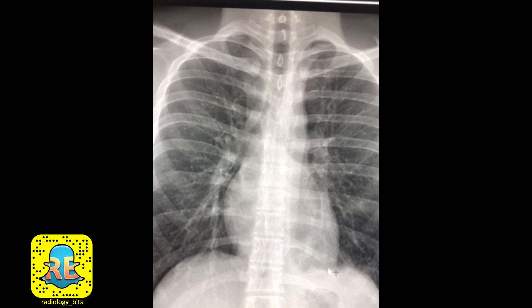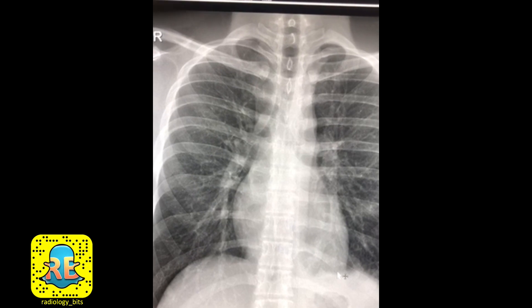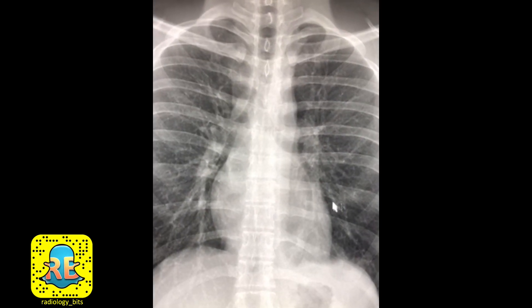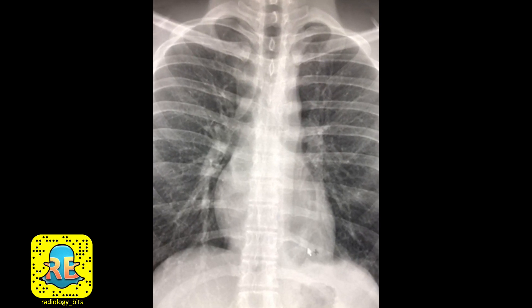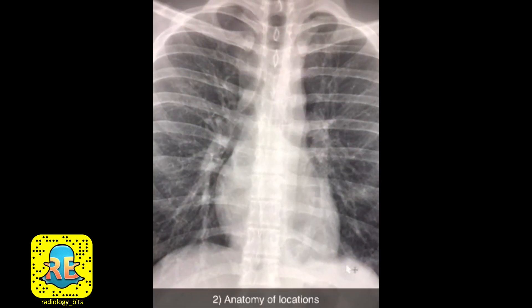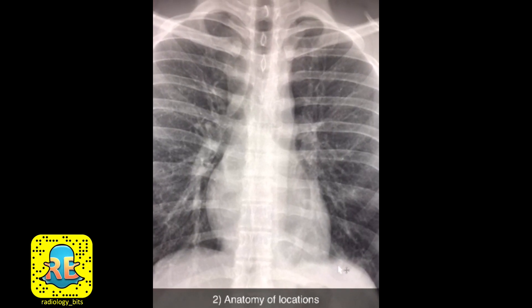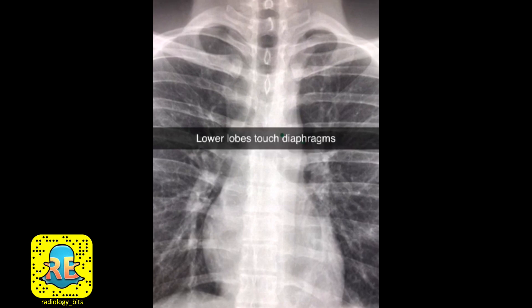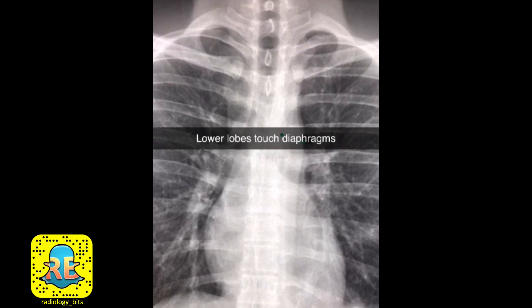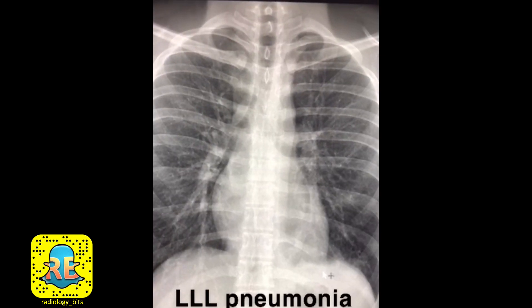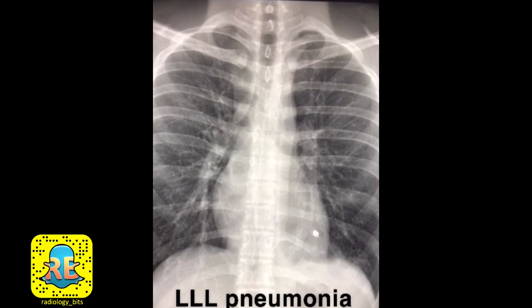Now to concept number two: for you to lose a border that should normally be seen, the abnormality should be in an adjacent structure. For example, the left upper lobe is adjacent to the left mediastinal border, while the left lower lobe is adjacent to the left hemidiaphragm. Knowing the anatomy and locations, and knowing that the lower lobes are adjacent to the diaphragms, this tells you that the opacity is in the left lower lobe. So in this case where pneumonia is suspected clinically, applying the clear border rule and anatomy of locations, you can identify left lower lobe pneumonia.